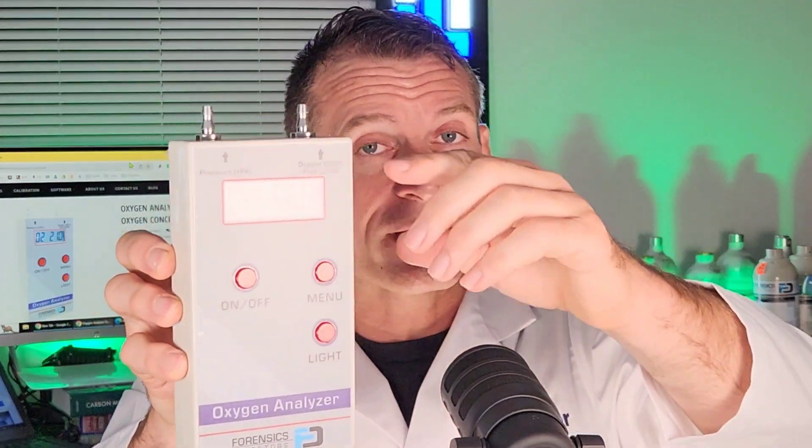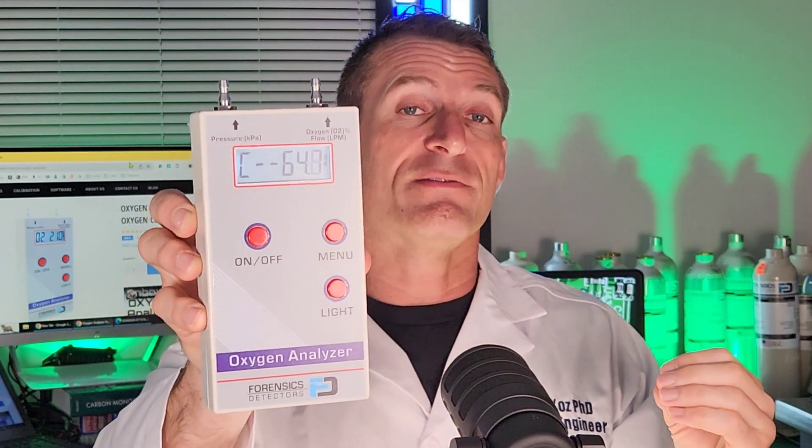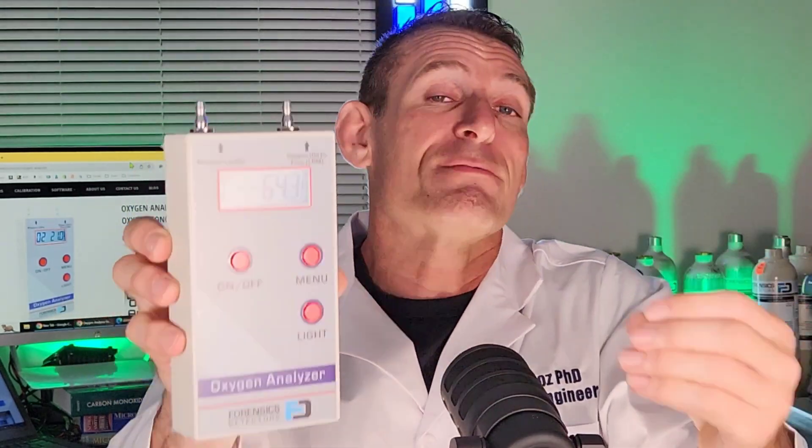If you want the reading to refresh, just pop it into the next machine and it will take that sample. You don't necessarily have to worry about it coming back down to 21% — that's not required. This is probably the most popular question we receive for the OXY 1000: why is it reading high and not refreshing? That's completely normal for this type of analyzer.